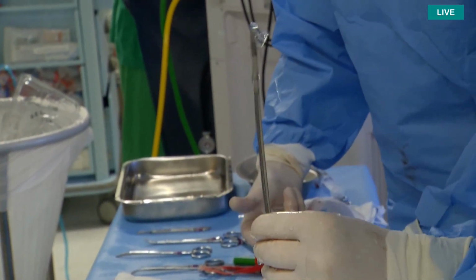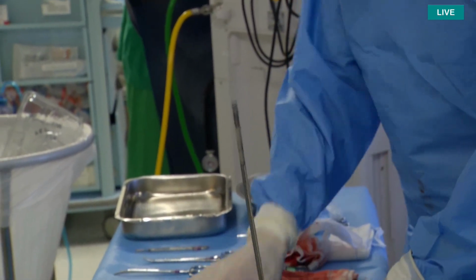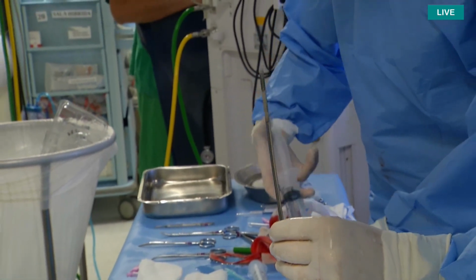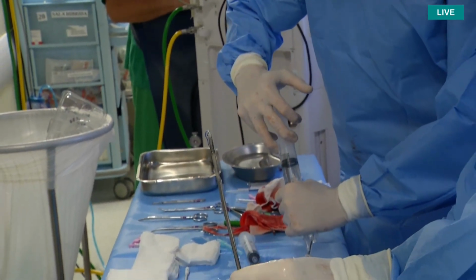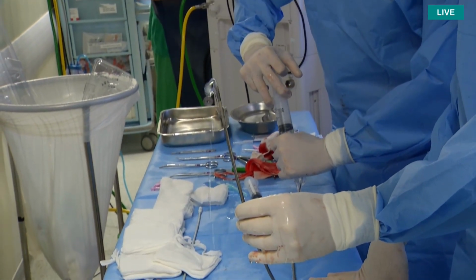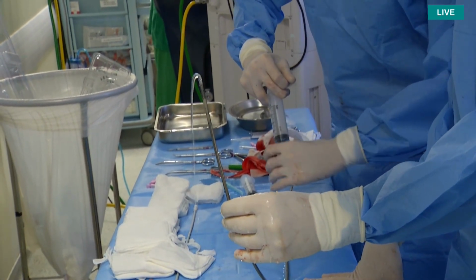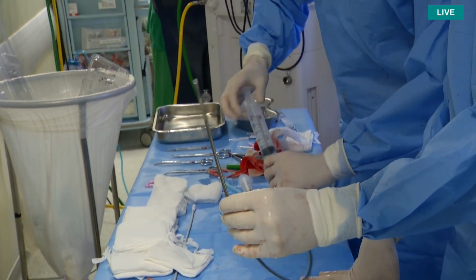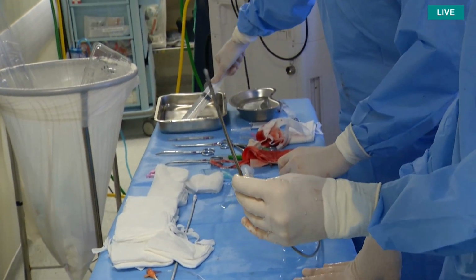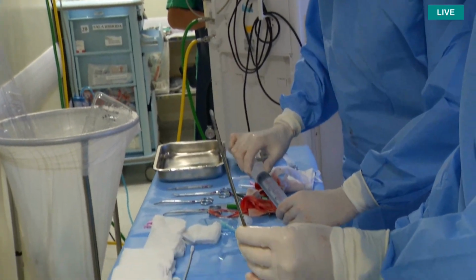It's really important to flush enough, I would say. You can't flush these devices enough. Let's get this full syringe of 50 cc, flush this completely, and then we take a new one. I don't think there should be any air in anymore, so now I'll take a full one to make the running-to-running connection when we go into the sheath. Okay, good. So we're almost there. The device is almost ready.